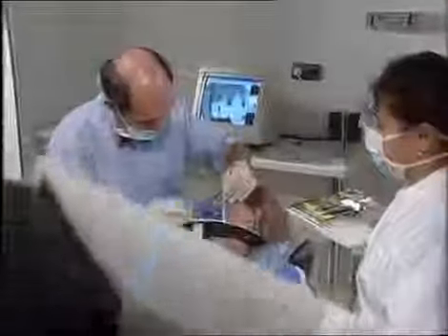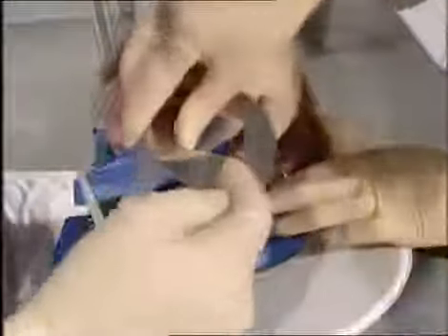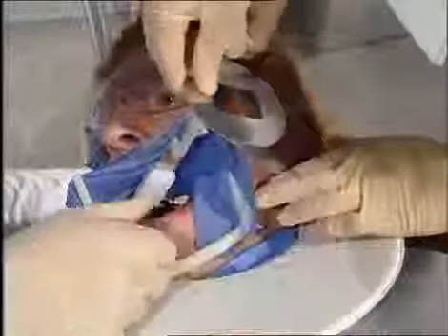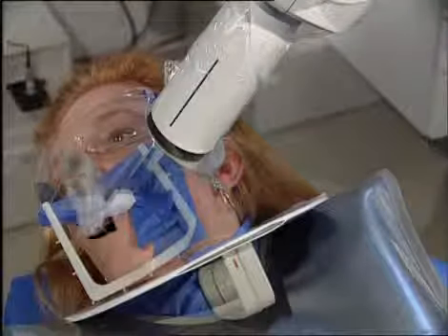The working length can now be checked with a radiograph. In order to get reproducible, high-quality films in the paralleling technique, the so-called beam guiding instruments can be used. They consist of a large and a small diaphragm, reducing the radiation exposure significantly. The cemento-dentinal junction is not clinically meaningful and may vary histologically up to several millimeters. The radiographic terminus is used as a reference.